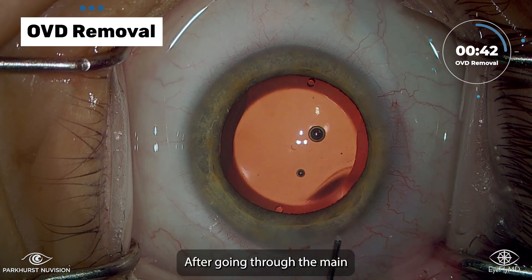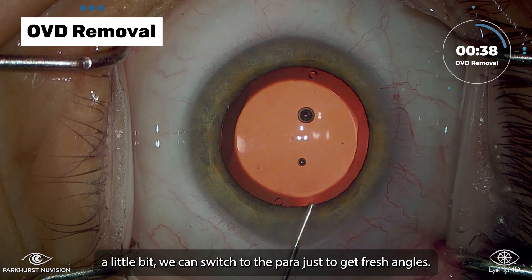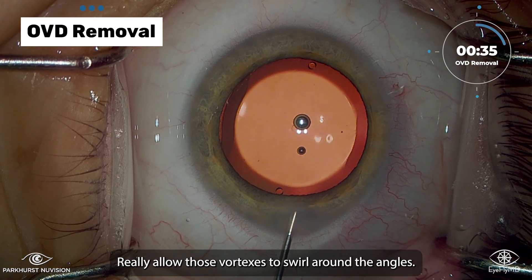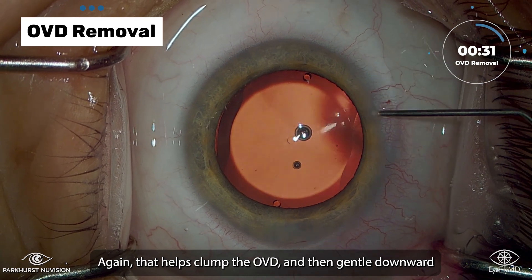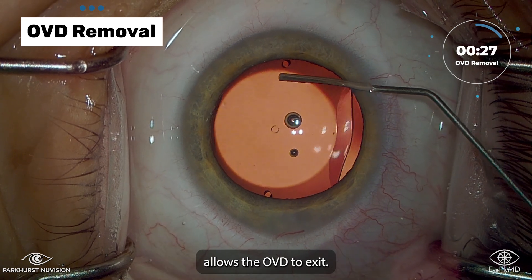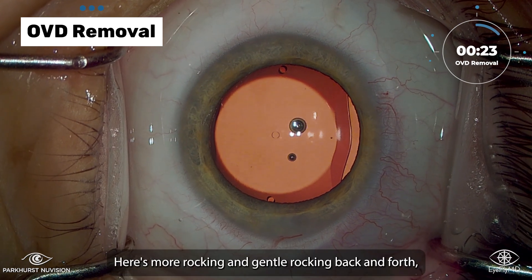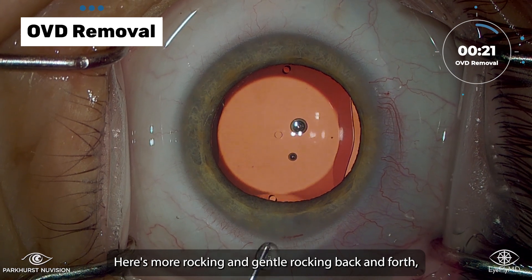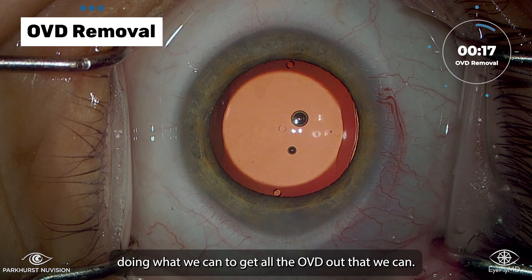After going through the main a little bit, we can switch to the para just to get fresh angles — really allowing those vortexes to swirl around the angles. That helps clump the OVD, and then gentle downward pulsing pressure on the main or the para allows the OVD to exit. Here's more gentle rocking back and forth, doing what we can to get all the OVD out.